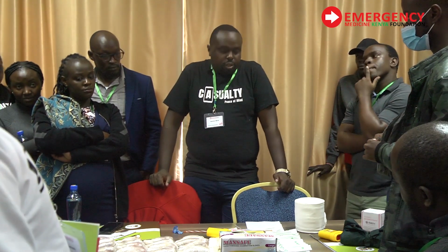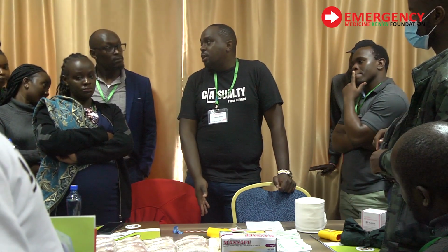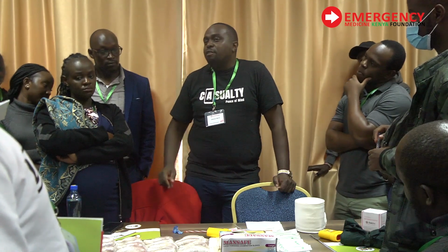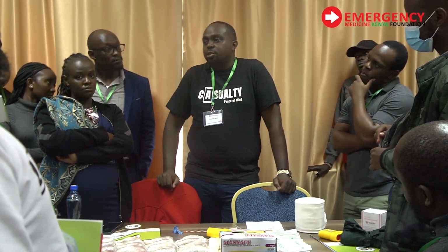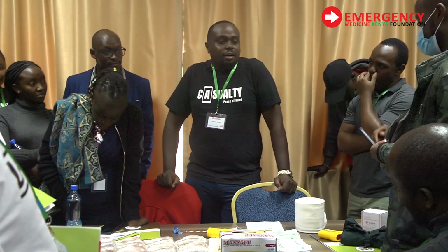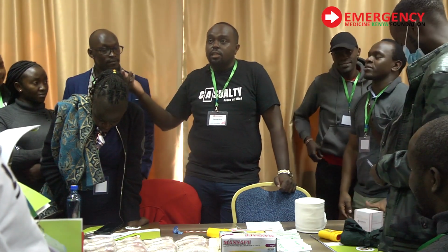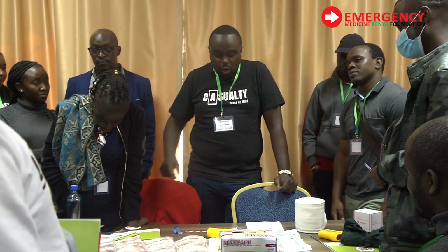Good. So what are the contraindications? Yeah, if you have skin infection at the site where you want to do intraosseous access, you don't want to proceed. If you have a recent surgery, for example, we all want to use the proximal tibia, but there was a knee replacement surgery on that knee. Will you proceed? No. Or you have a patient who has bilateral above knee amputation, it's not possible, isn't it? So basically you'll have to choose other sites and make a decision on what to do.